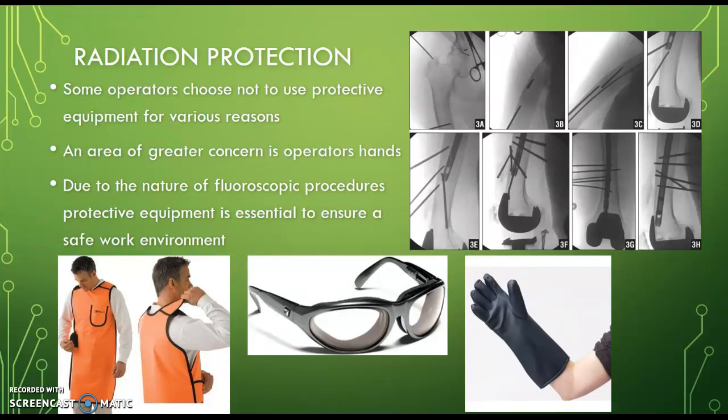Because there is a higher radiation dose for both patients and any medical personnel, radiation protection is of utmost importance. Although some operators choose not to wear their protective equipment, a 2004 survey states that 50% of respondents reported spinal problems due to the weight of lead shields.